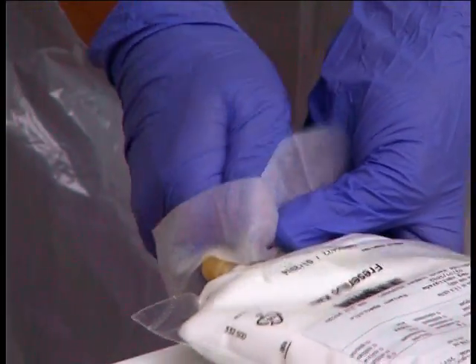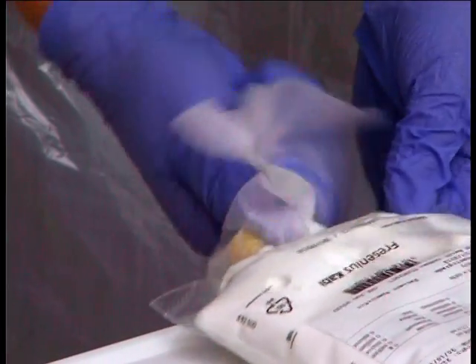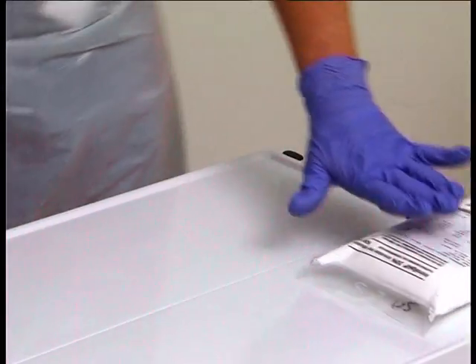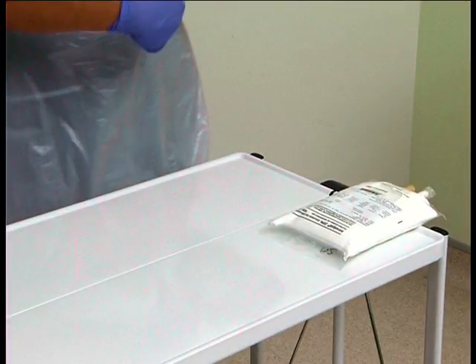Leave this to air dry for at least 30 seconds, and longer if it looks wet, to ensure that any bacteria are killed. If necessary, move the bag so that the cleaned connection will not be at risk of contamination whilst you carry out the next part of the procedure.